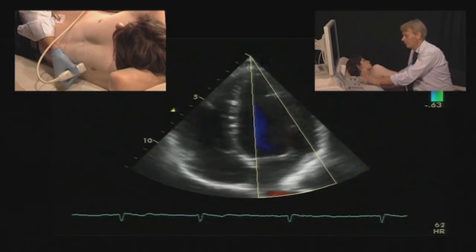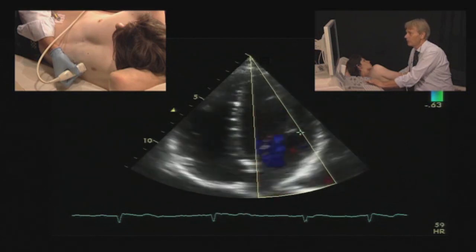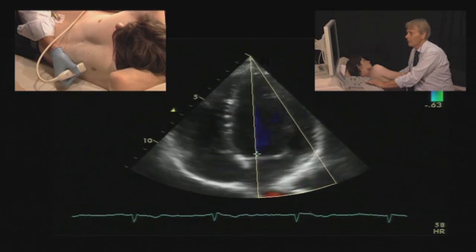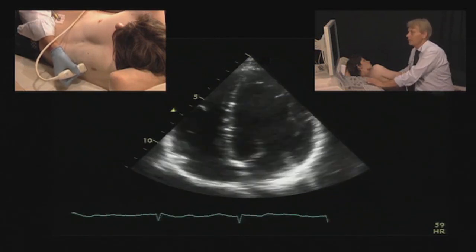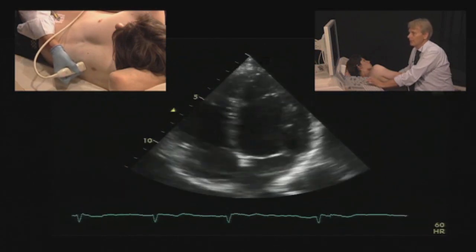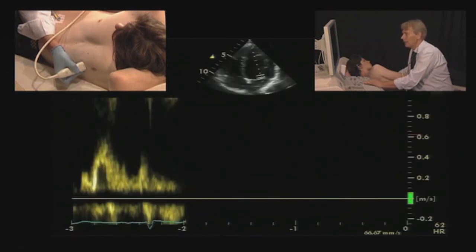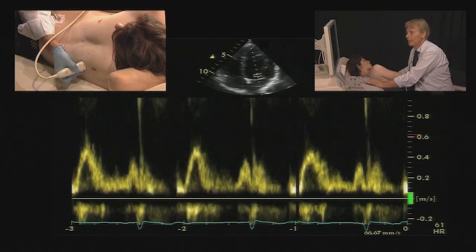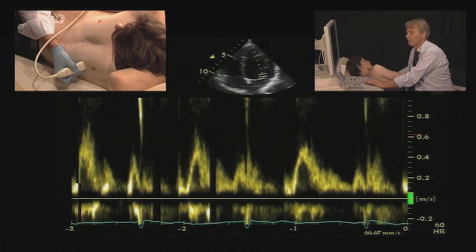In the normal ventricle, which is not dilated, the flow is directed more towards the lateral wall and then turns around and goes towards the LVOT. So to place your sample, you have to consider this, and also consider that the posterior leaflet is shorter than the anterior leaflet. So this is the region where I have the sample volume now, where I would place the sample volume. It's not in the middle of the ventricle, but it's more towards the lateral wall.